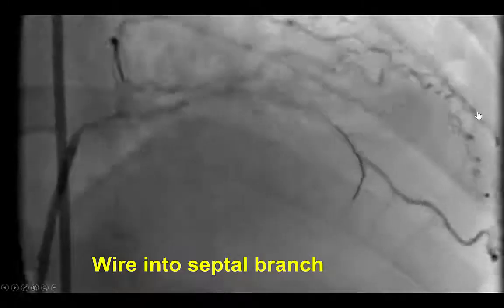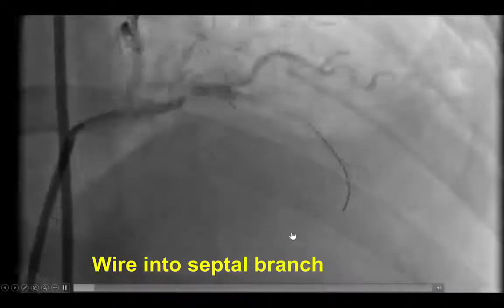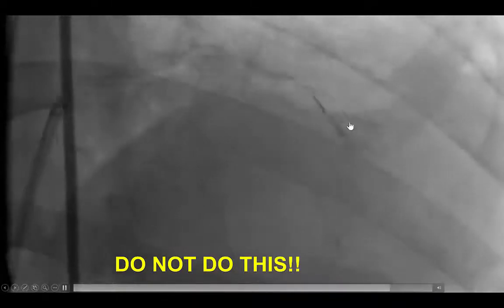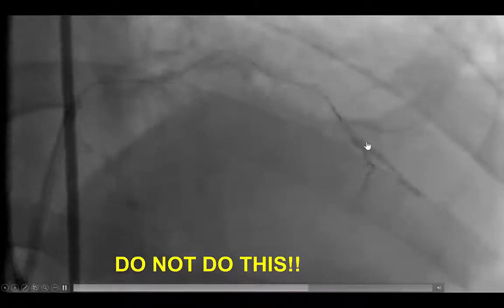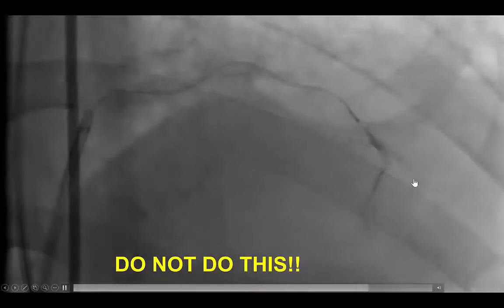In this particular case, the wire moved but then entered a septal branch further down in the vessel. This is something that we should, in general, not do — advance a microcatheter and then do a contrast injection — because if we were subintimal, that could significantly cause a hematoma and prevent further attempts at entering the distal true lumen. In this case, however, we were fairly confident we were within the true lumen and wanted to better delineate the course of the vessel.